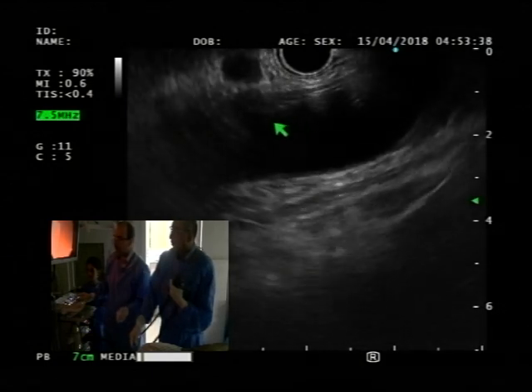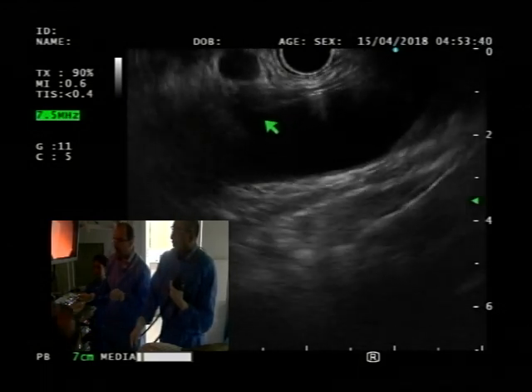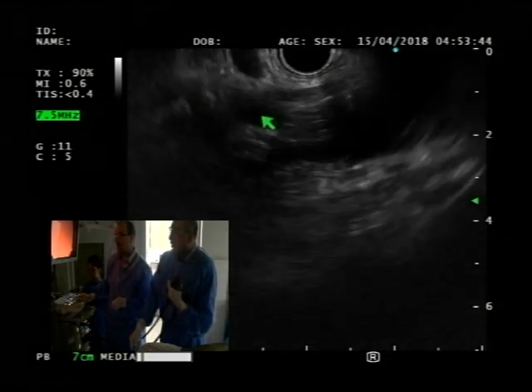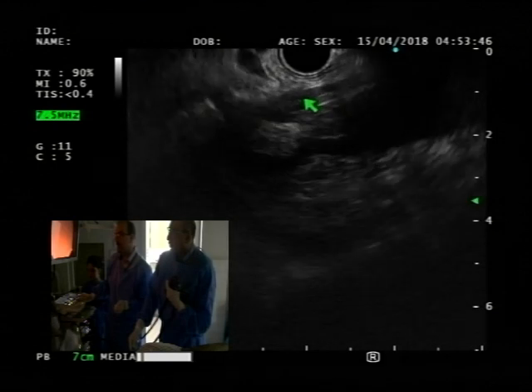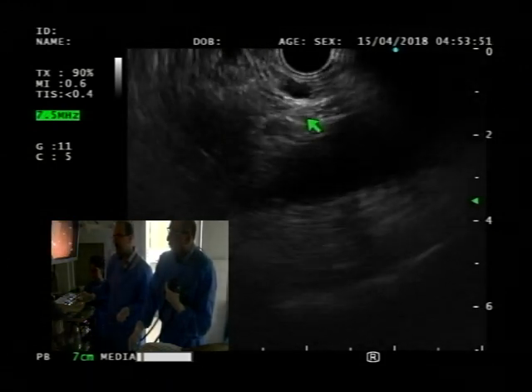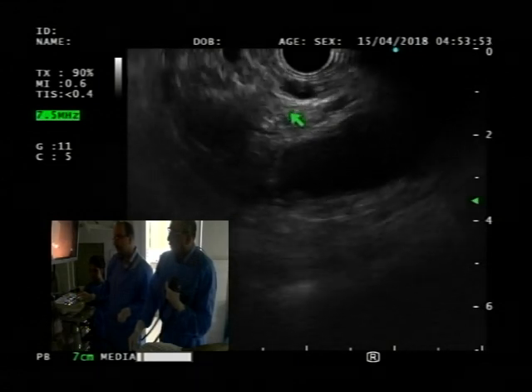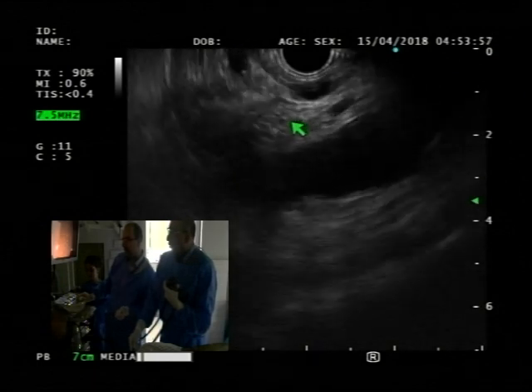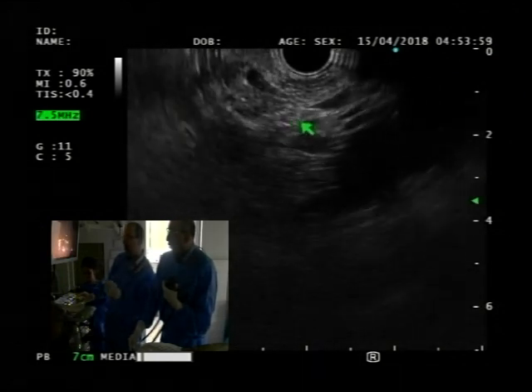Now you have this. Now advance, keeping this in view, gently advance. There's your celiac coming off. Okay, there's the crest of the diaphragm. Now you advance and you want to follow the celiac. Beautiful. This is exactly what you want to do. Follow it. Unless that's already the SMA. Yeah, that's actually following the SMA.